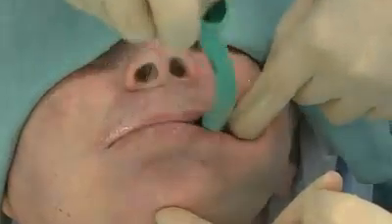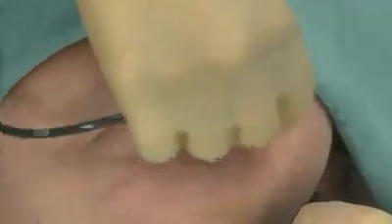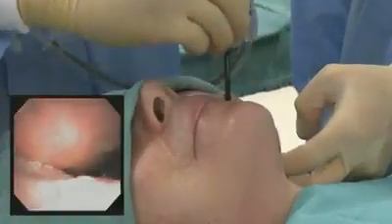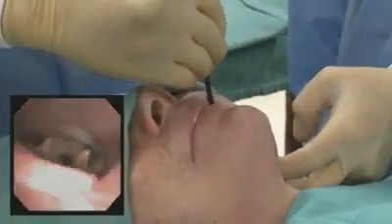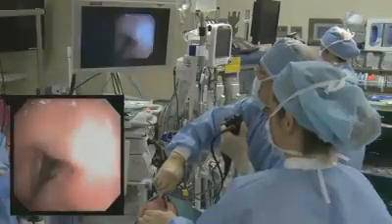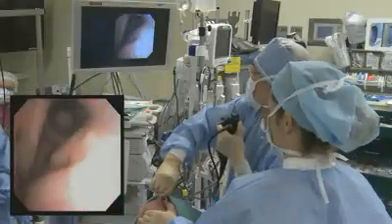Arm the fibroscope with a well-lubricated tracheal tube. Insert the scope in the corner of the mouth behind the last molar to the retromolar space. Once in the pharyngeal cavity, follow the curved path between the maxillary and mandibular teeth. Curve the scope slightly to identify the glottic opening. It is a short distance to the glottis, no more than 10 centimeters.